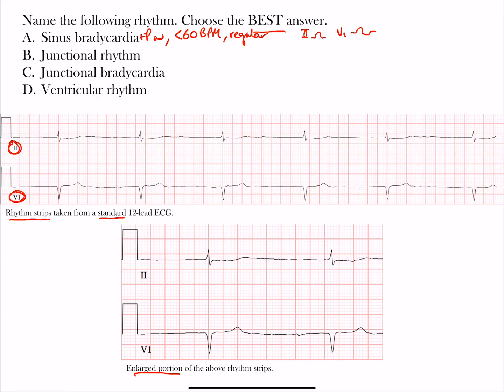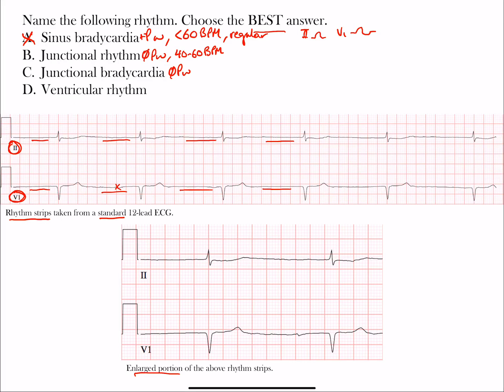Looking at the strip, there are actually no P waves — whether you look in lead 2 or V1, there are no P waves present. So sinus bradycardia is not correct; that hopefully narrows it down. Now, junctional rhythm also has no P waves, and so does junctional bradycardia. Junctional rhythm has a rate between 40 and 60 beats per minute, while junctional bradycardia is when the rate is below 40 beats per minute. Both are regular rhythms.